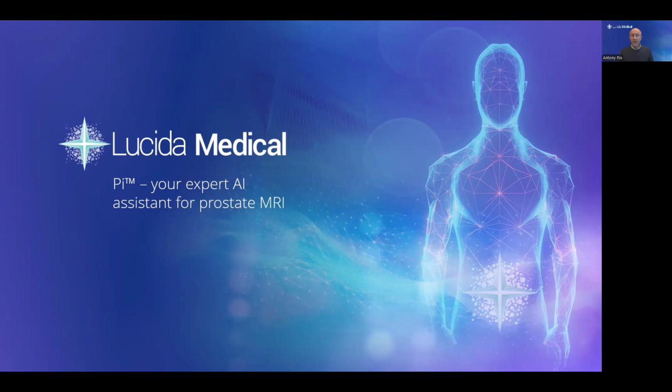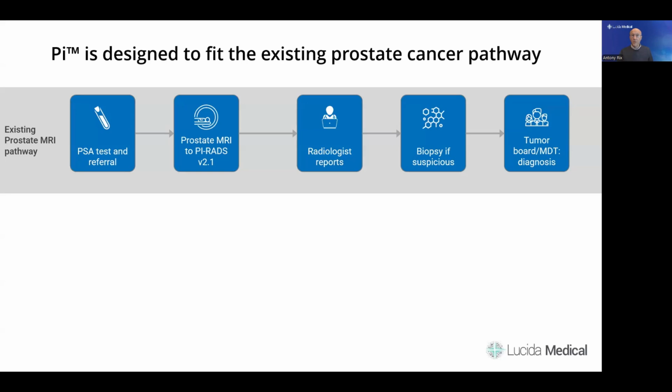This video provides a short introduction to Lucida Medical's PI solution for prostate MRI. PI is intended to complement the existing prostate cancer pathway. The typical pathway where MRI is performed prior to biopsy is shown here.